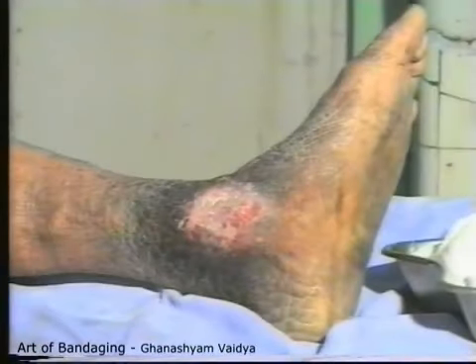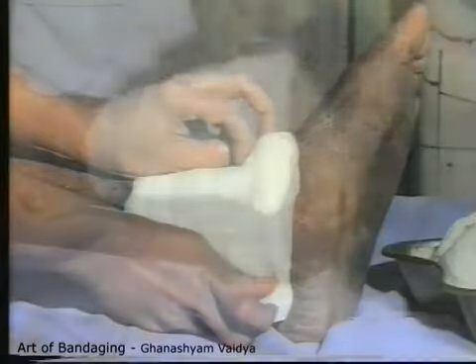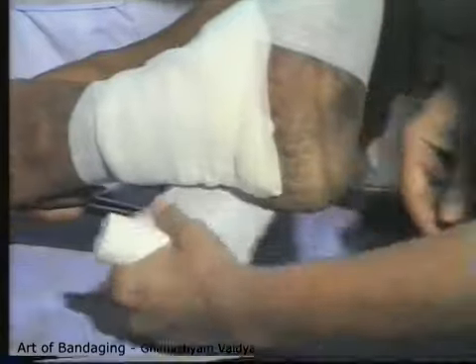The most common use of a bandage is to hold dressings in position. Note this ulcer on the medial aspect of left ankle, covered with gauze and gamgee dressing, which I am holding with my hand. Now watch the bandage as it covers and supports the dressing, holding it in place. The bandage also supports the injured part and gives it rest by restricting movements. See this sling given to the right arm, which supports the arm and shoulders and gives them rest.